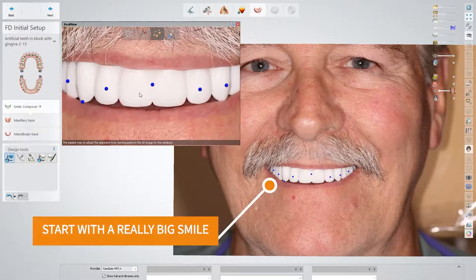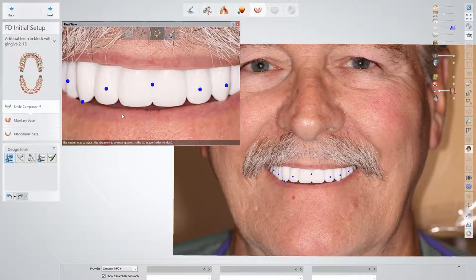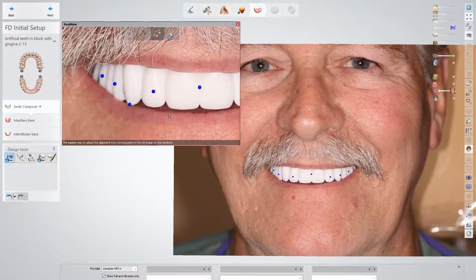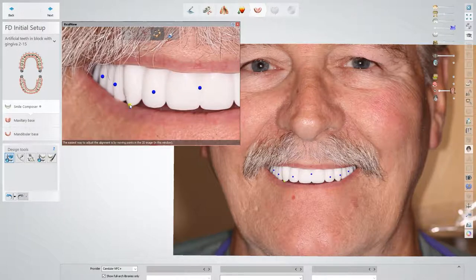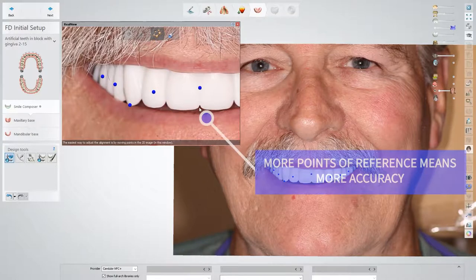The first thing you want to do is start with a really big smile. Get that full face, full frontal view of a smile of your patient, revealing as much anatomy of the try-in as possible so that we can go into the software using this tool.